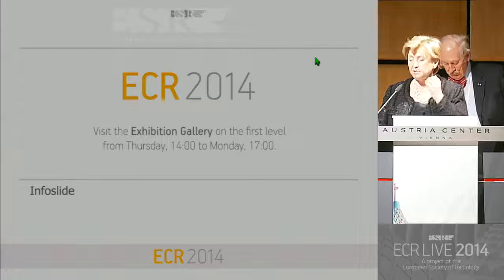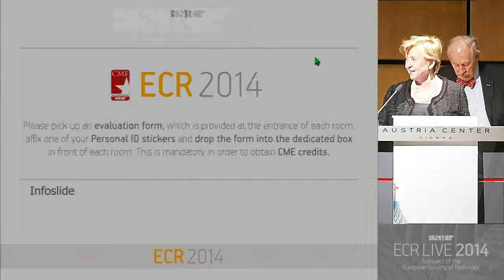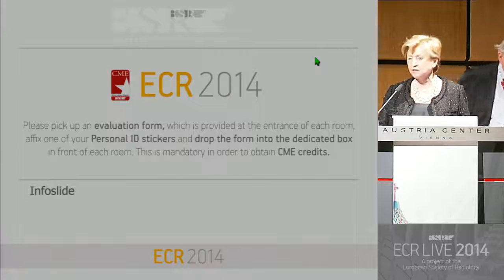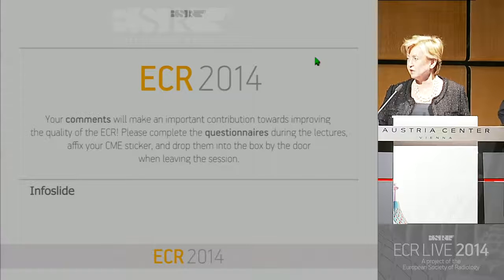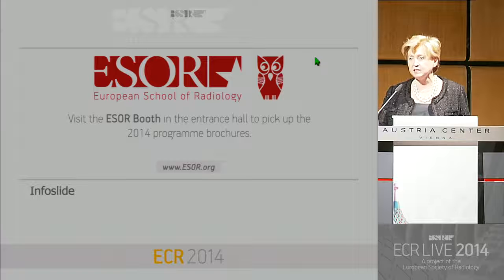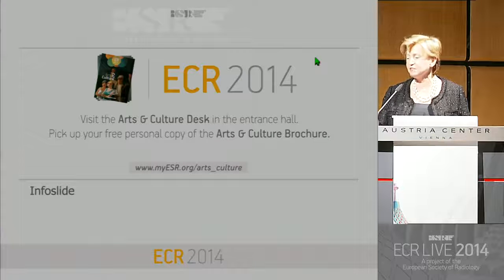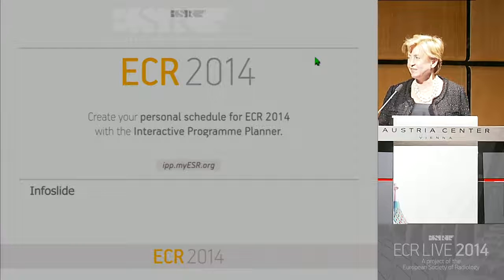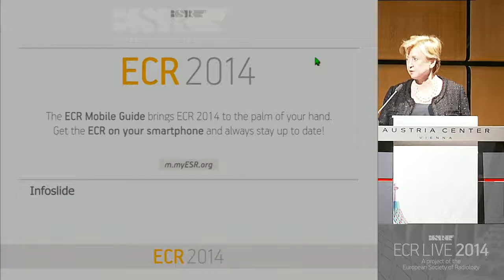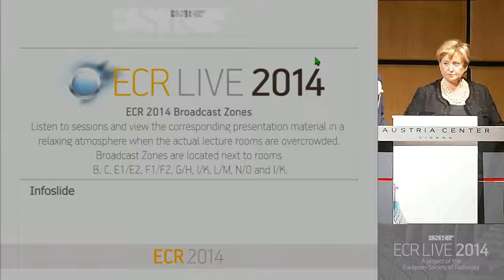Because a diffusion-weighted image really doesn't take any time, and there is no contrast involved, probably we should, for the routine, go to a little higher B-value, but we have to consider that so many people are doing MRI on 1.5 Tesla. So we really need to discuss what is a clinically routine, clinically relevant protocol, as opposed to a research protocol.